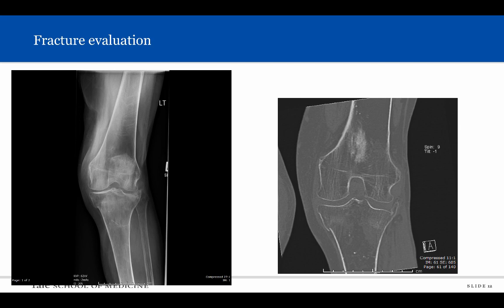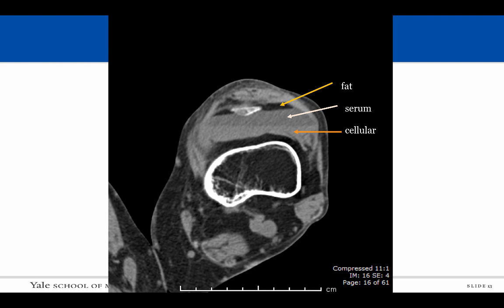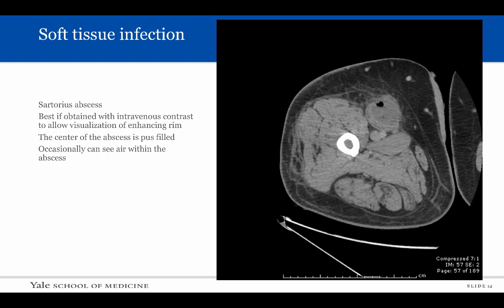Here we have the same patient with the intraarticular tibial plateau fracture you saw earlier. The corresponding coronal CT image clearly demonstrates the depression of the lateral tibial plateau articular surface and allows better visualization of a break along the medial tibial metaphyseal cortex. The axial image shows the CT equivalent of the patient's lipohemarthrosis in greater detail. The fat, serum, and cellular components are easily seen and are referred to as the parfait sign.